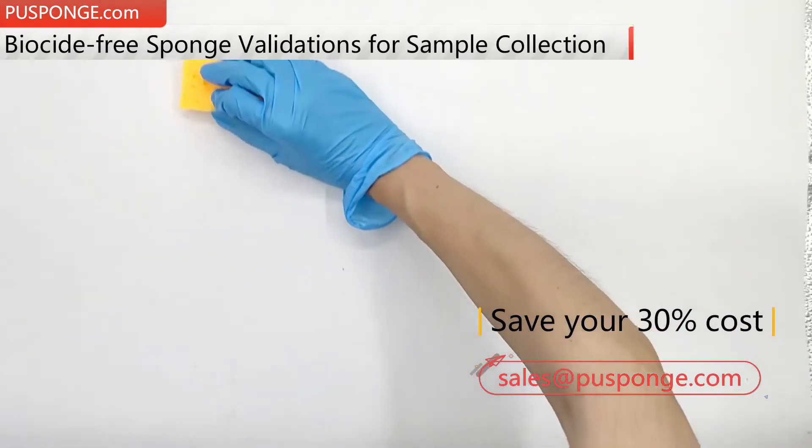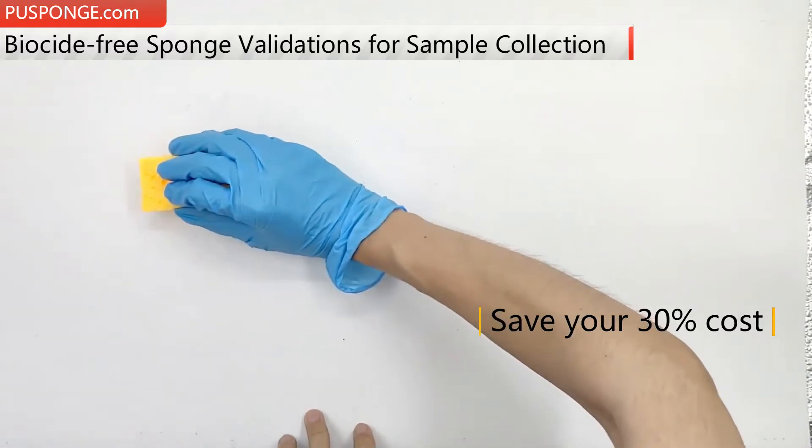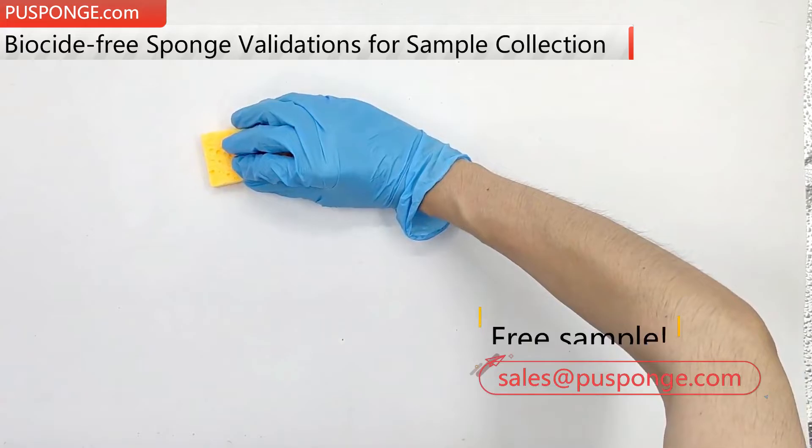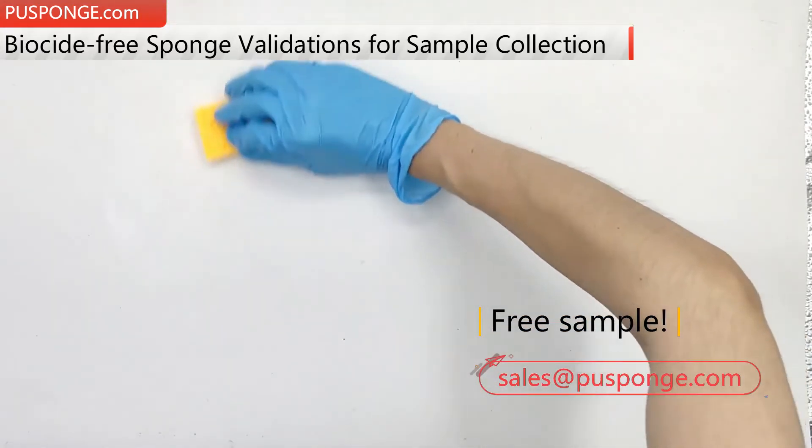Q-Sponge cellulose sponges are developed and produced entirely by ourselves, with performance as close to identical as 3M's. However, the cost is just about 70% of 3M's.